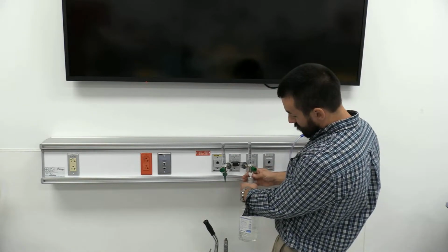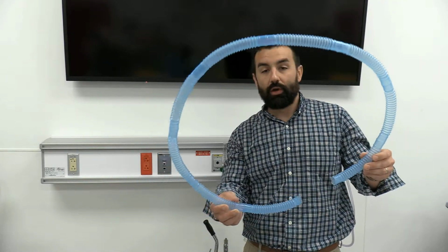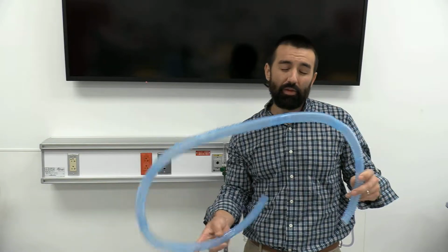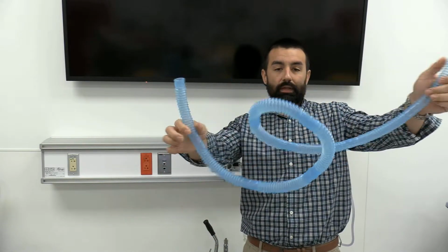So once again, if I'm having trouble, pop that flow meter off and throw that thing on directly and pop it back in. So as far as making connections, some places you'll have one ginormous spool of 100 yards of this stuff and you're cutting pieces off. Other places you can buy kind of prepackaged little pieces of this stuff.